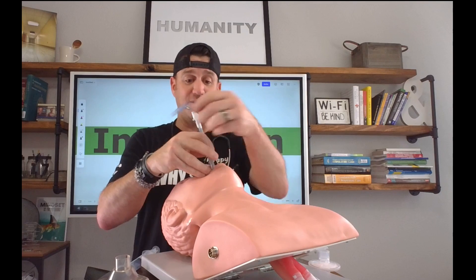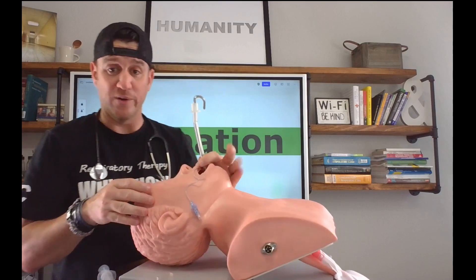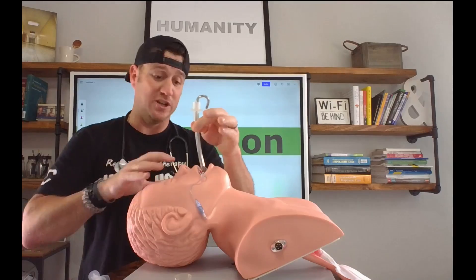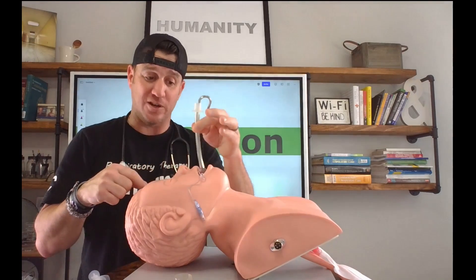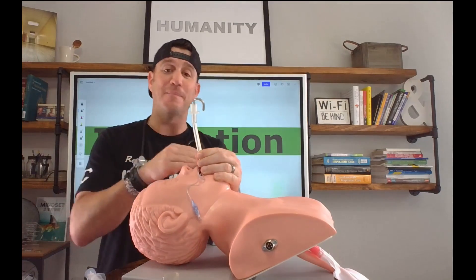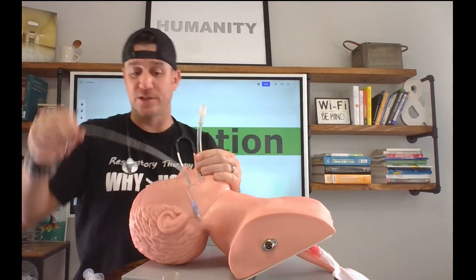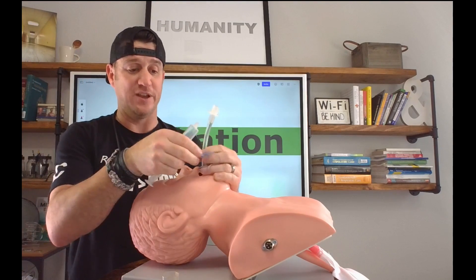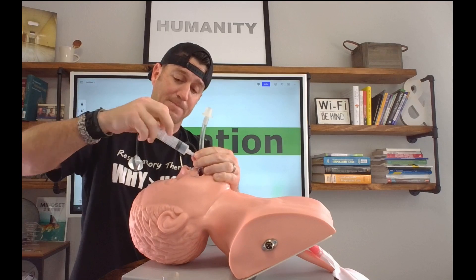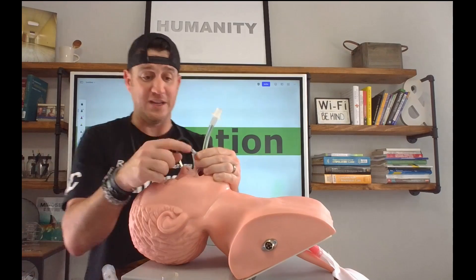I've got my tube secured. I'm going to hold here with my left hand. Notice I've got it secured not just holding it up here — because if the patient's head starts to shake back and forth, I can lose it like this also. So I'm going to secure my hand to their chin and then hold like this. Wherever their head goes, I go with it. Stylet comes out. I need to inflate this cuff — you need some manual dexterity here to do two things at once. I'm still holding the tube but I'm also holding my pilot balloon to inflate.